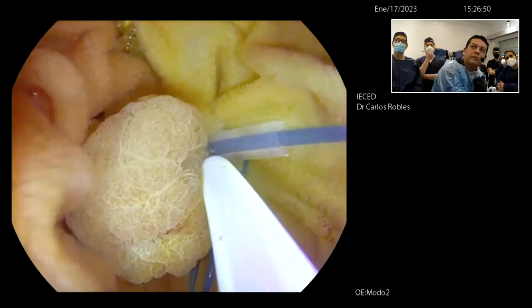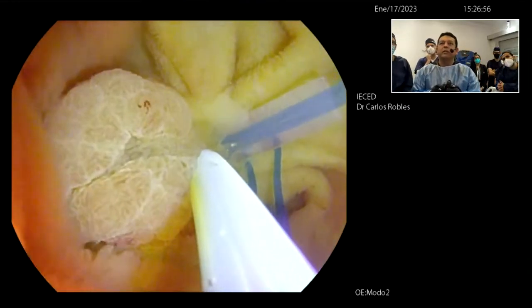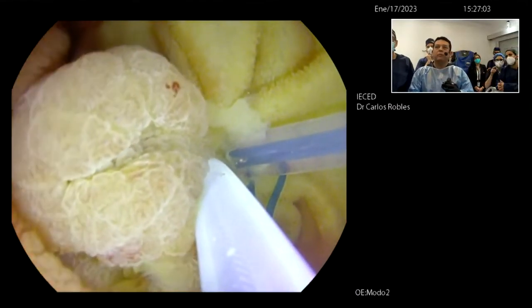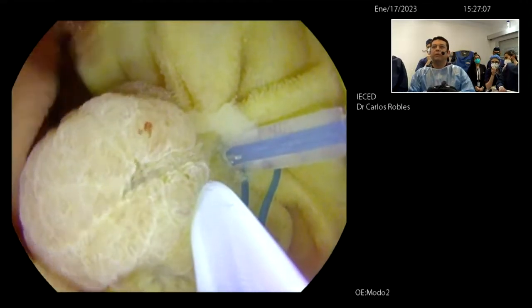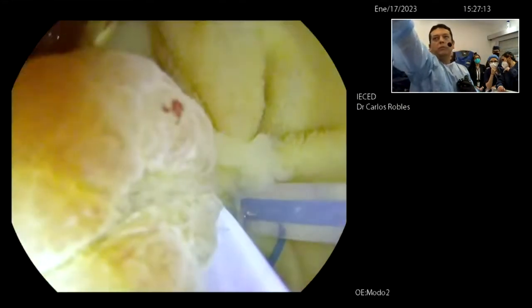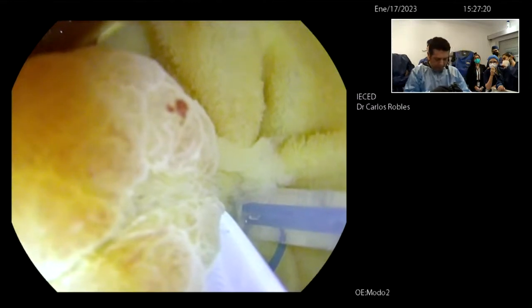Close slowly. So now I want to see if I will not cut at least the endo loop, okay? So I open a little. I want to see that I am very well. I believe I am very well. Close. Okay, perfect. Because I see the blue here, of my endo loop. So I believe I am fine. So I will cut now.